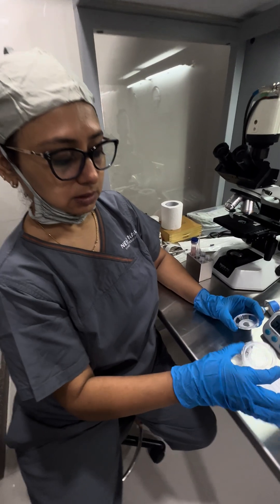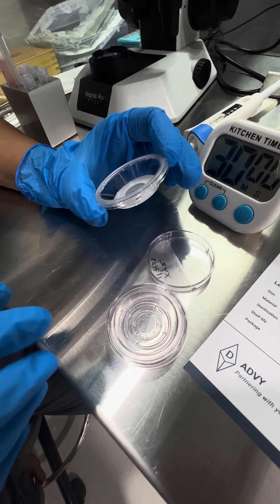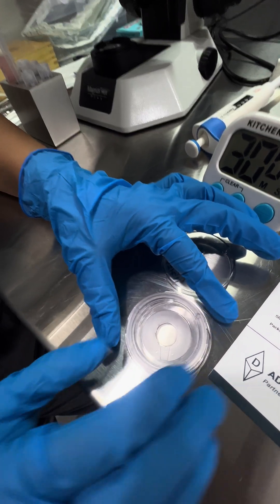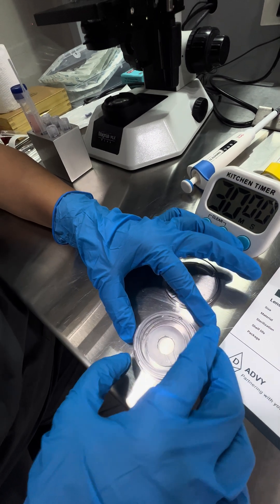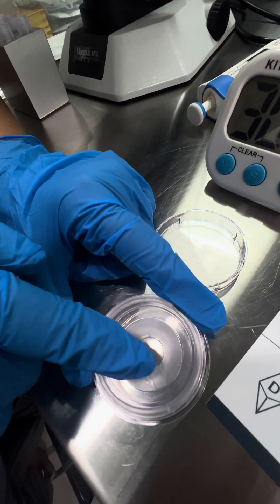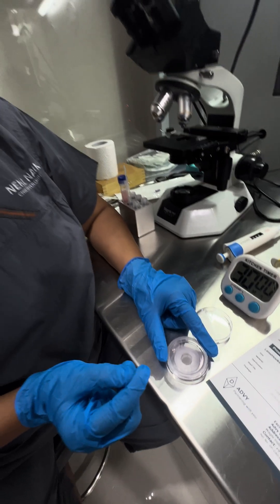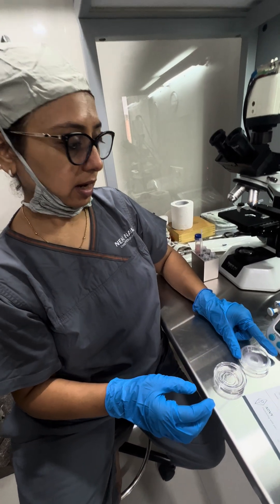This is the plate, this is the base. Here we have to put 1 ml of raw semen sample. This is the filter which we put on it with just a little bit of a turn. Then after 30 minutes, we will collect the sample from the groove where we will get the good sperms with low DFI. So now we will start the demo.